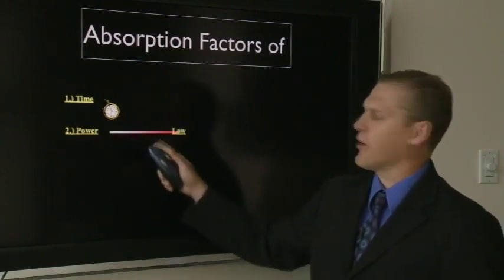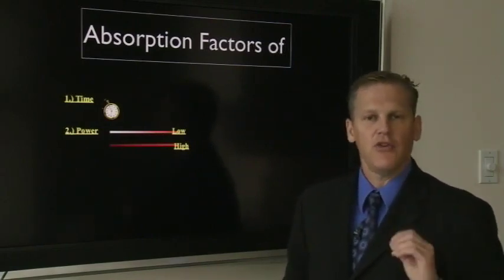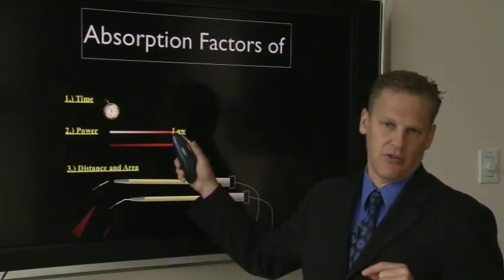The second thing is power. It's like the radio in your car. You can turn it up or turn it down. And you will find that the more magnification you use, the lower the power that you'll need to accomplish the same task.